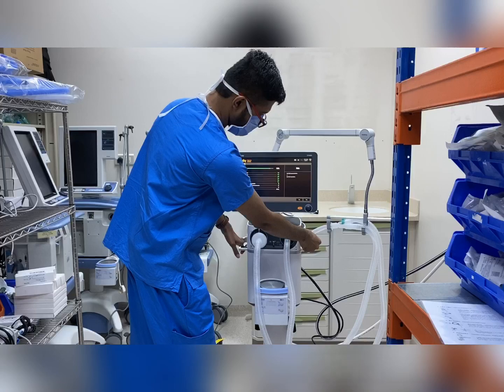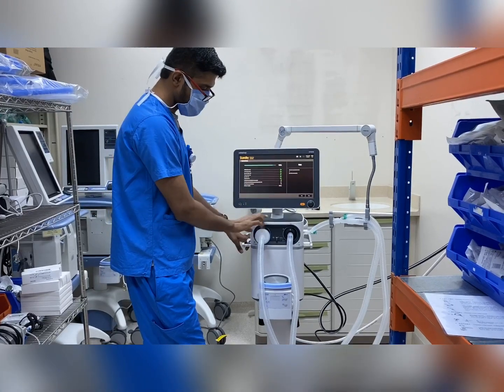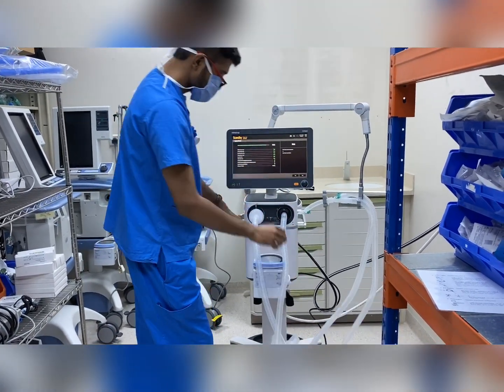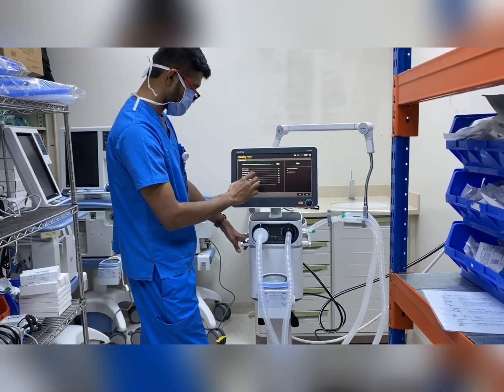We have to connect the circuit and hook the machine for calibration, because the machine will always run calibration when it is on. This is the expiratory side of the machine and this is the inspiratory side. The expiratory side is connected and calibration is now running.